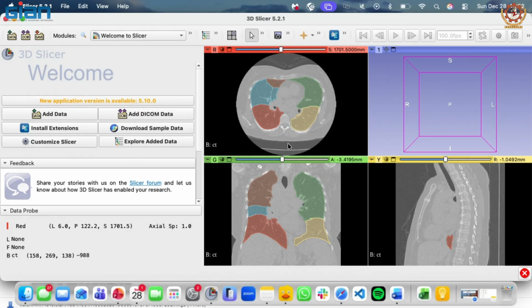So if you are trying to design a deep learning model, the first thing that should come to you is that there should be some criteria, which we call loss functions in deep learning. You can penalize the model for predicting the lobe segmentation outside the lung, right? For example, if you're trying to segment a tumor, you don't know where the tumor is, but it should not be outside the CT. Bare minimum requirement is that. So you can penalize the model so that it should not be outside the CT space, it should not be outside the lung, something like that.